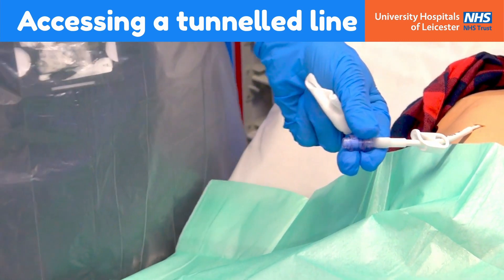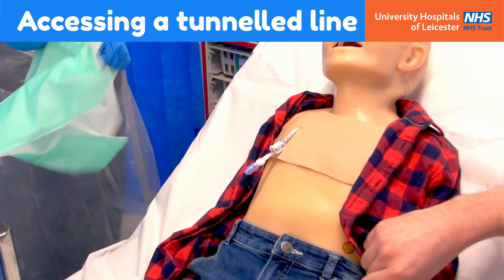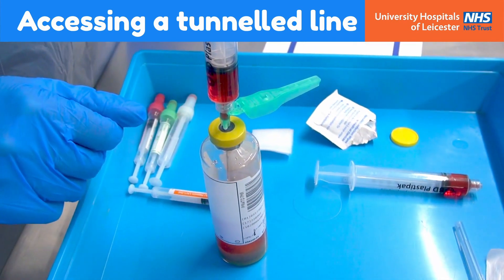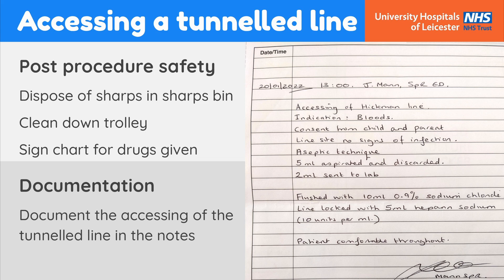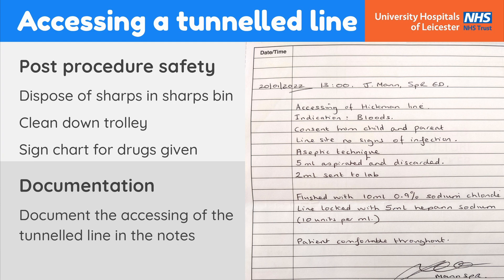Clamp the tubing before syringe changes using the positive pressure technique. Transfer blood samples into the appropriate bottles and label these by the bedside. After the procedure, ensure that sharps are disposed of in the sharps bin, equipment is cleaned down and the administered drugs are signed for on the patient's drug chart. Make sure you document this procedure in the patient's notes.